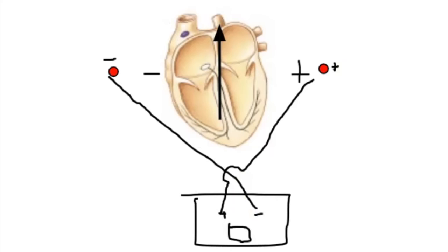Well, if you're trying to take a really robust, you can get some idea of electrical signal propagation with 2 electrodes, right? You can have an idea if the axis of signal propagation is super off. But if you had more angles, in theory, you could look more closely at different propagation in different directions. And so that might point you towards different pathologies that you might miss if you didn't have as many angles looking at the heart.